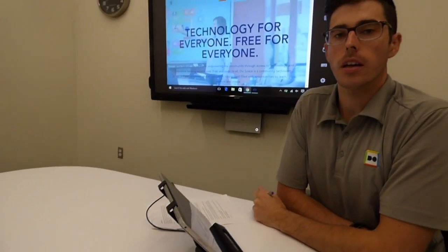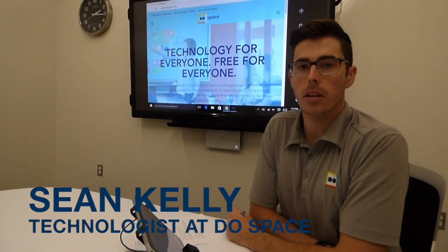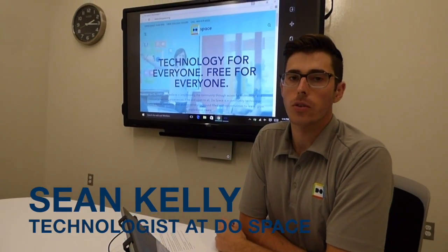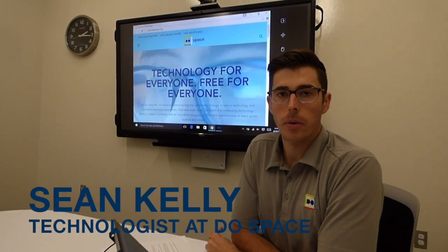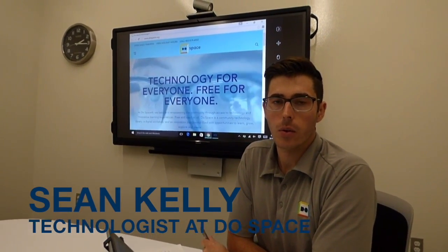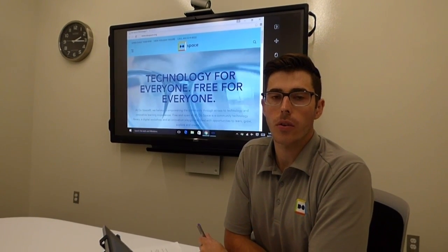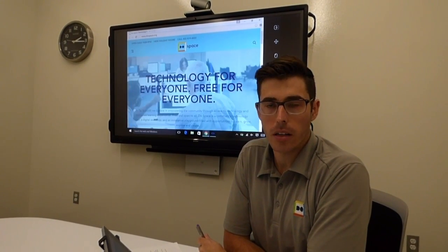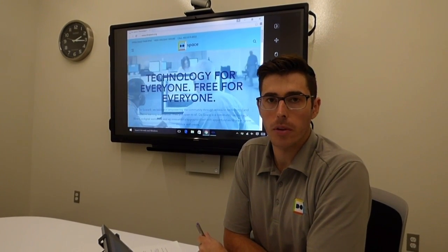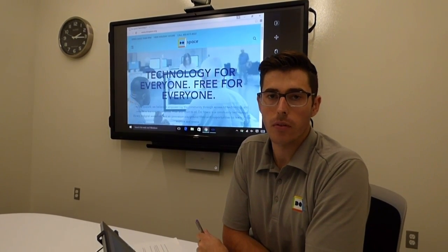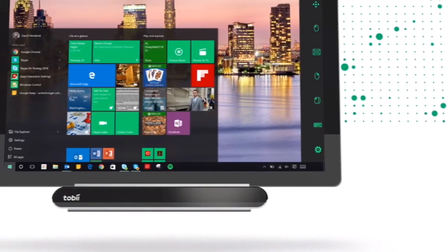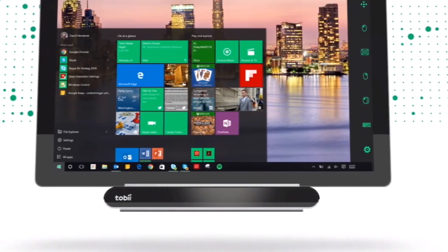My name is Sean Kelly and I'm a part-time technologist here at DoSpace. I'm here today to give you a quick demonstration on how to correctly calibrate the Tobii eye-mobile tech kit that we have here at DoSpace.